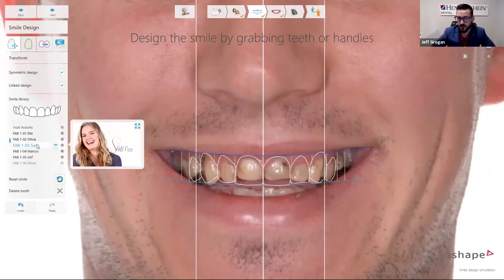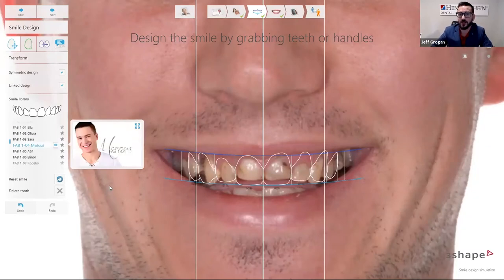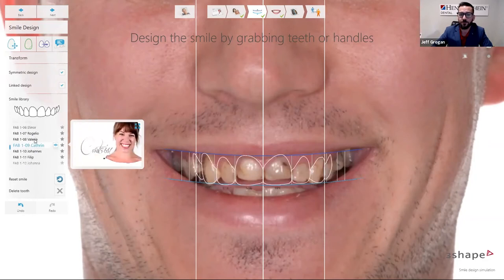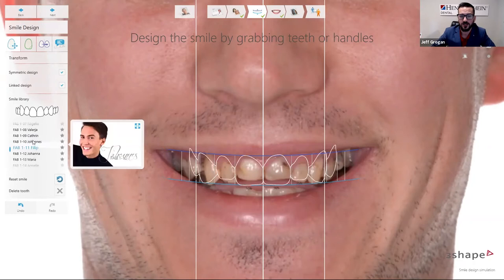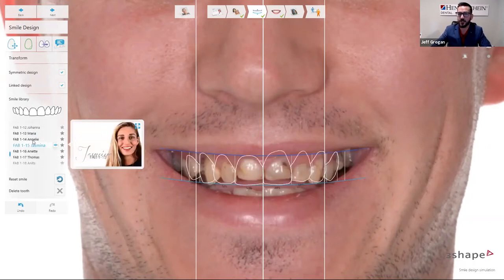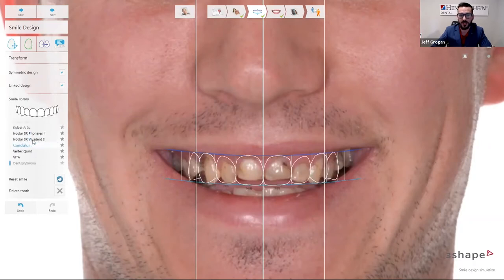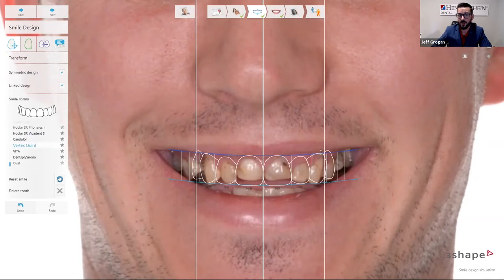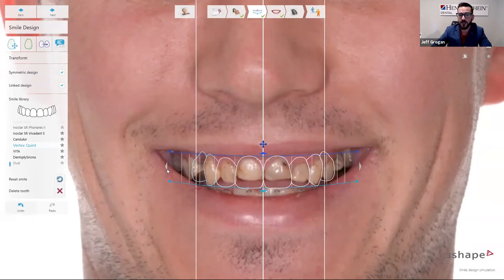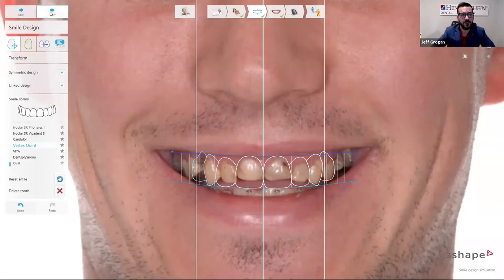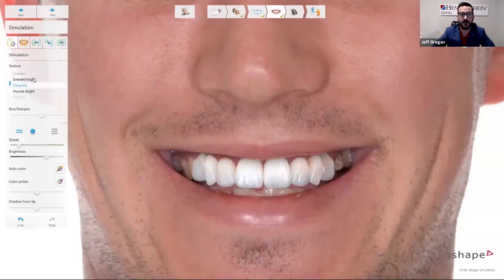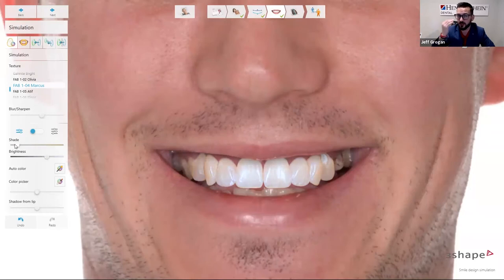I have a variety of different libraries to choose from. This is where you really engage and excite your patients — sitting down chairside, patients can actually design their own smile, their own virtual wax-up. As I'm talking to this patient, he may scroll through and like a particular design. I can then use that template and expand, contract, and adjust the curvature of the mouth to fit what would actually be his new smile. The next step is to assign a texture — I also have many options, can scroll through to find the best representation, and adjust shading, brightness, or shadows. All of those are customizable tools.